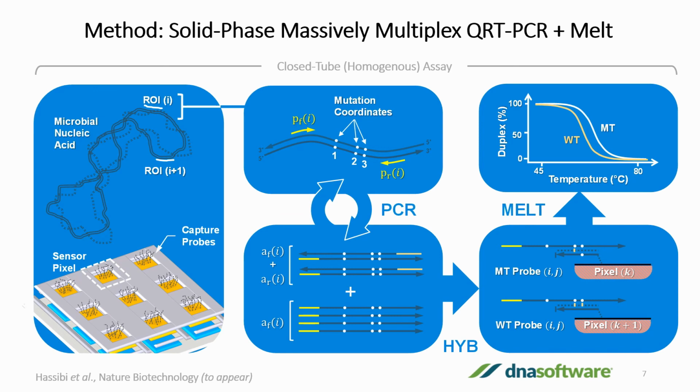However, when we have this in the reaction chamber, we also put in the reaction chamber an oligonucleotide array with capture probes with unique sequences. These are embedded on a sensor array which can detect the capturing of the nucleic acid, or the hybridization of the target with the nucleic acid, in real time when the solution is present.